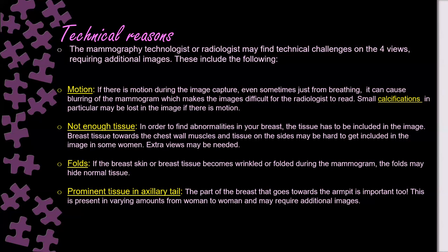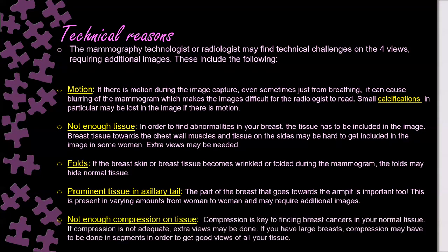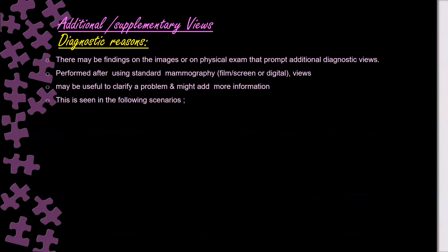You might see that this patient still has tissue in the axillary tail. You need to extend your view to see it well, or not enough compression on the tissue. You need to do further compression to make it clear. This regarding the technical reason.